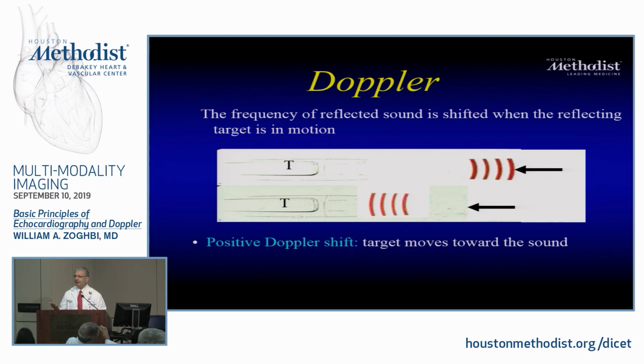So what is this Doppler thing? Simplistically, okay, if I send this 3 megahertz, which I can't hear, right? If I send it out and there's no motion whatsoever, whatever is reflected is going to be the same frequency. It's going to be 3. But if Carlos is moving, either coming towards me or going away, the motion of this person is going to shift the frequency.